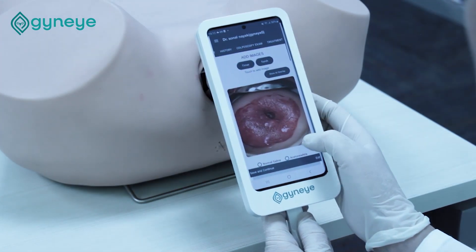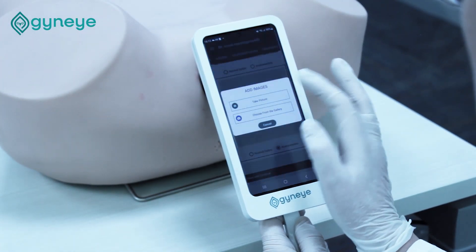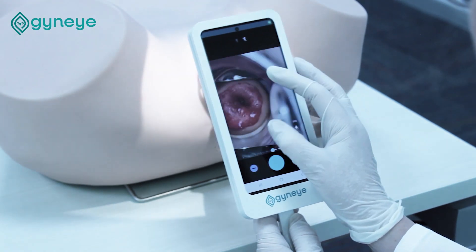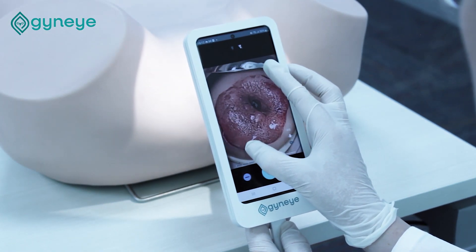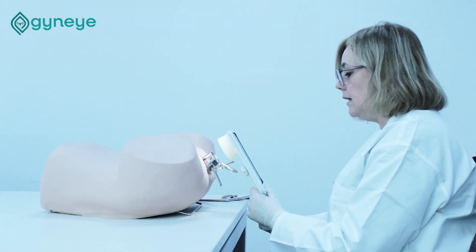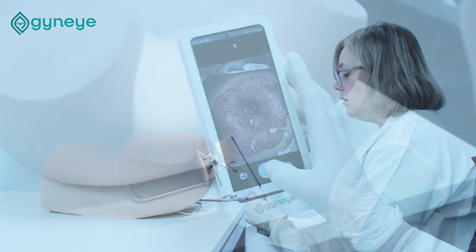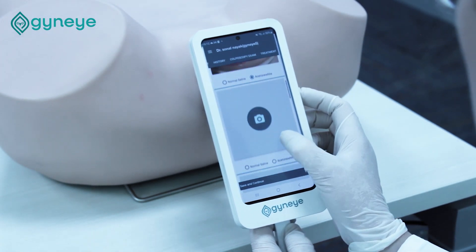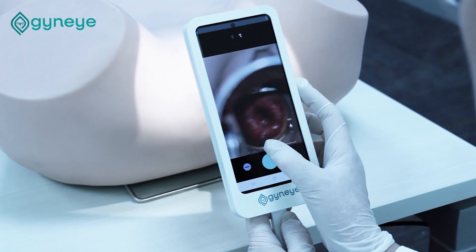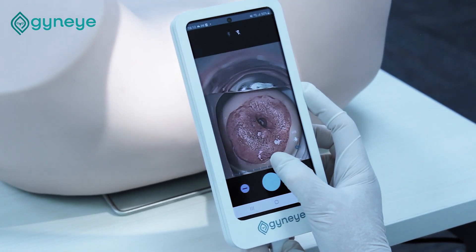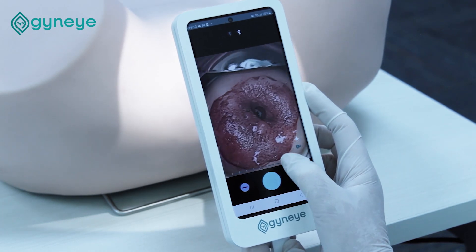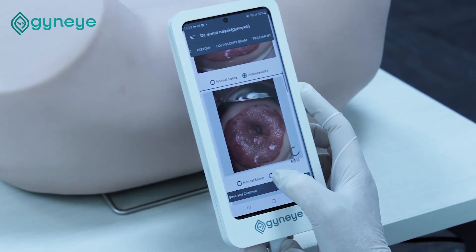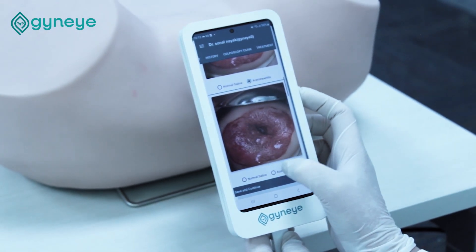You can now start your colposcopic examination for acetic whitening. You can take additional two images. You can adjust the magnification, adjust the outer focus by tilting the camera, and optimize the light and the view. The next part is evaluating the cervix with the green filter.